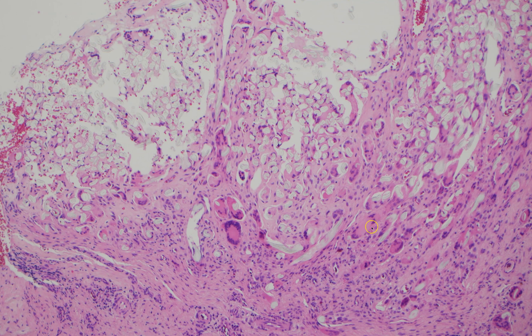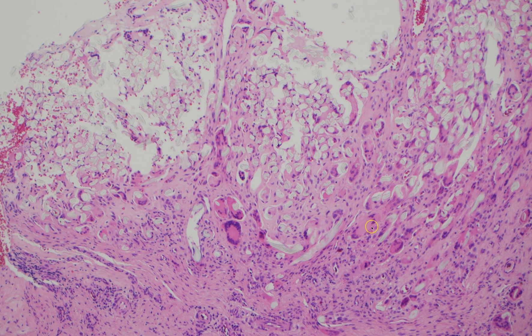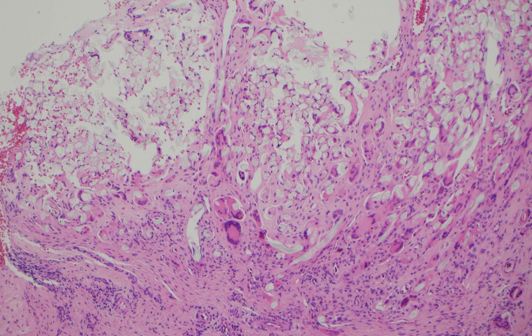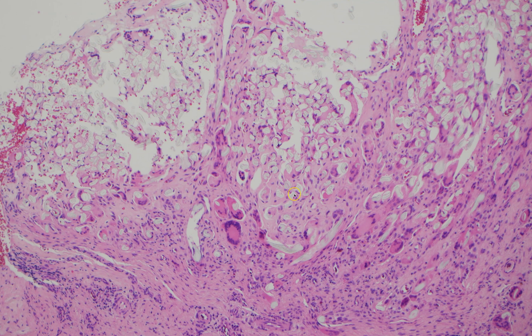A granuloma is a combination of histiocytes, sometimes with giant cells. There are a bunch of different types of granulomas, but in this case the granuloma is forming because there's foreign material in the soft tissue, and the immune system does not like that.